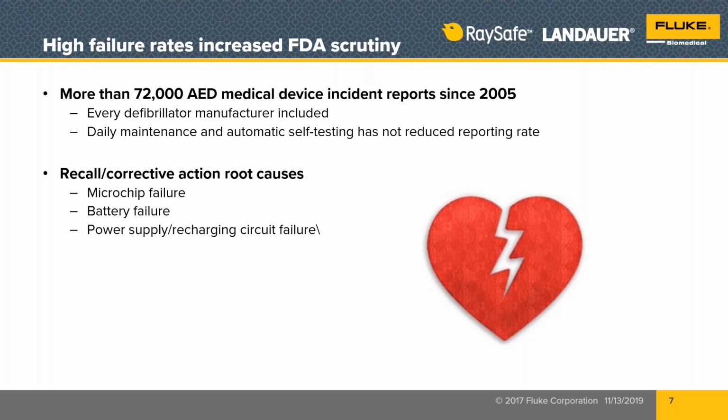And to Justin's point, they are the kind of device that gets beat up a lot just in the normal use of them and moving to the point where we can get to the patient. It's not all smooth hallways like just inside the hospital. So you can have a look for yourself, not only about defibrillators, but other medical devices, right on the US FDA website.